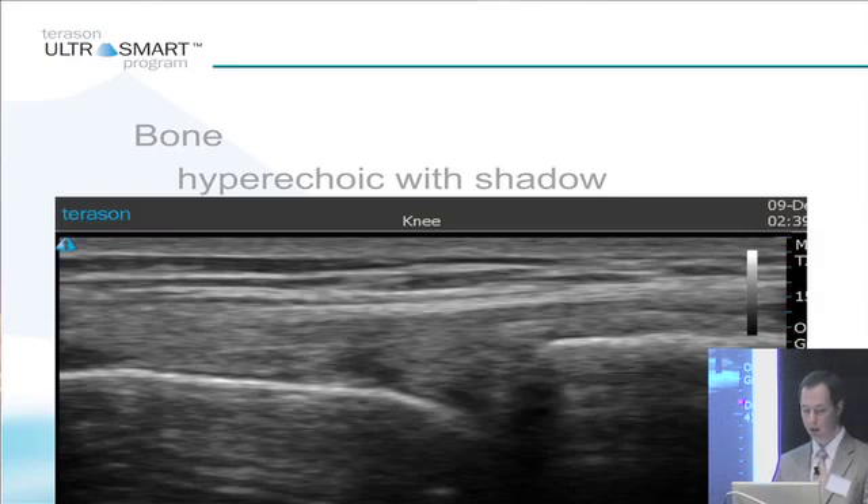Bone will look hyperechoic — that's on the bottom of the screen, that's bright — and it usually has a shadow which is deep to it. You see this sort of bright signal here and this layering of this bright signal. That's just reverberation. What that is is reverberation of this bright signal; it's so bright and so intense that it reverberates down.